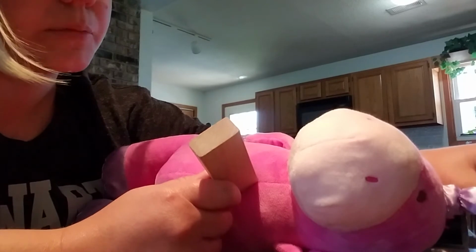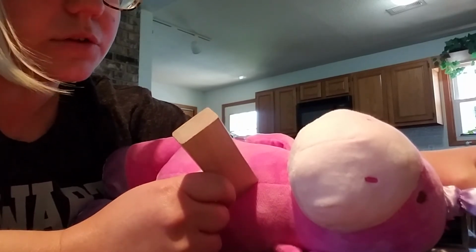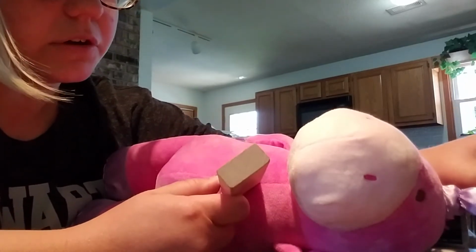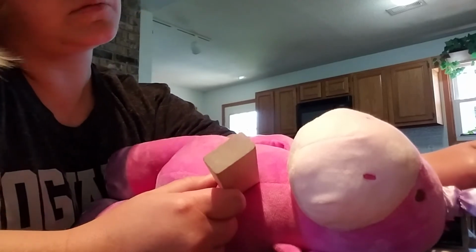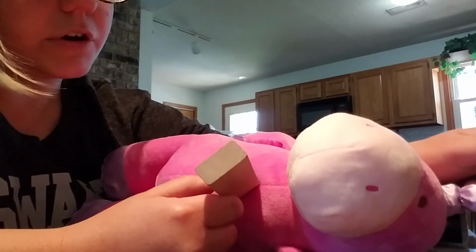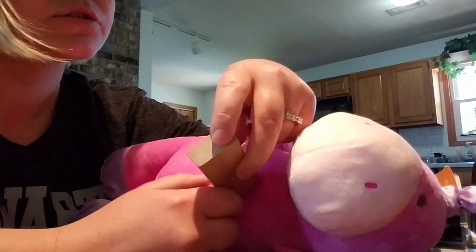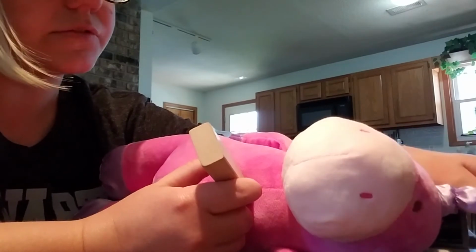So you're going to pan superiorly for your pulmonic valve, where you would do your cine loop, color compare, and Doppler measurements. Pan inferiorly for your tricuspid valve, where you would do your cine loop, color compare, and your Doppler measurements. And then you would move on to your parasternal short axis. So you're going to turn your indicator towards your patient's left shoulder, and this will give you your parasternal short axis view.